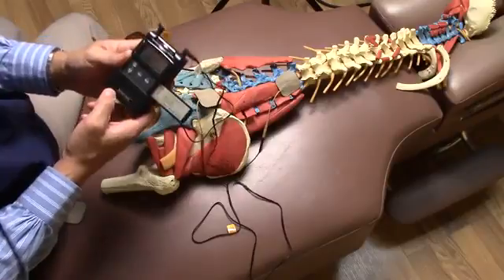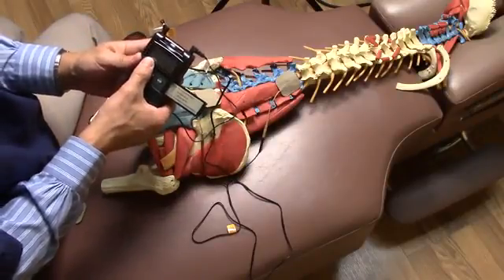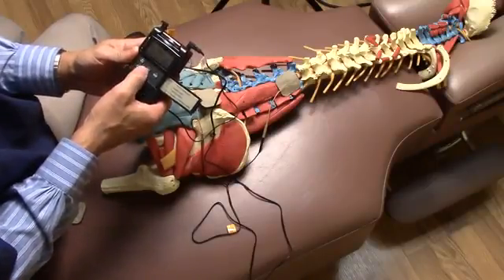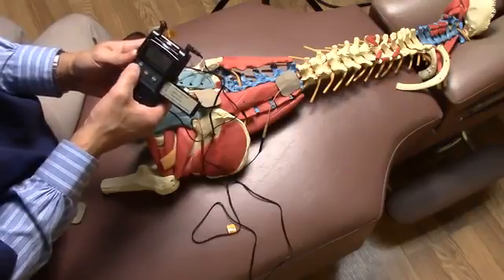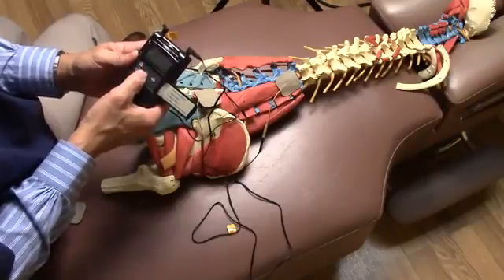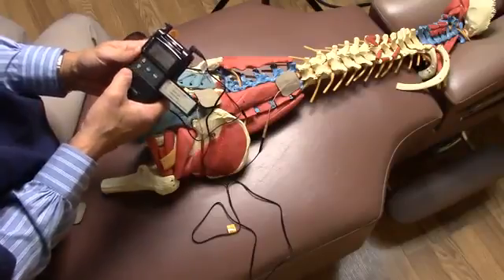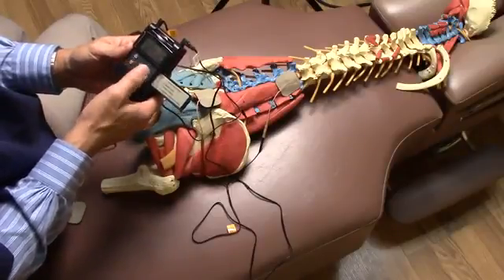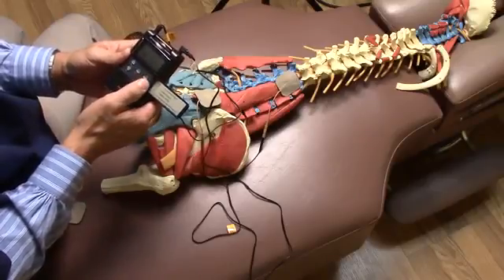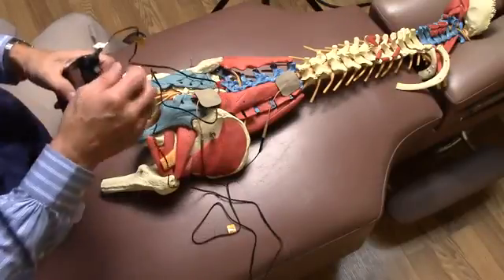If you want to make changes to the settings, you press set, and the number that blinks, you can make it higher or lower. This is the pulse width. Press it again, you get the frequency, 100 Hertz, 102 Hertz. You could increase it or decrease it. Press it again, and you could change the treatment time. It's like a countdown timer. If you put 25 minutes, it'll turn off automatically after 25 minutes. Press set again, press mode, and just relax. Okay, I'm going to turn it off again.